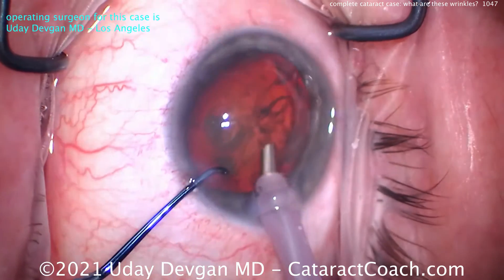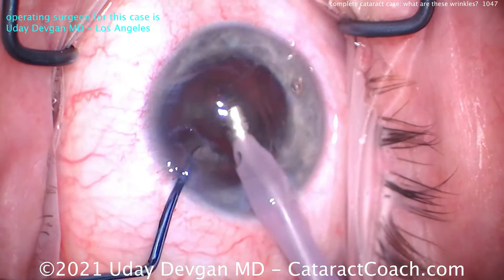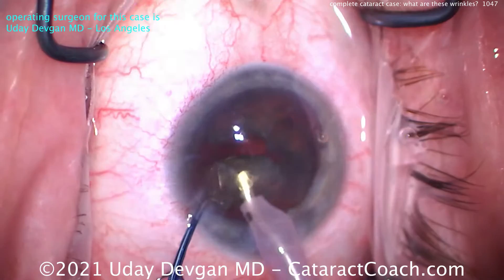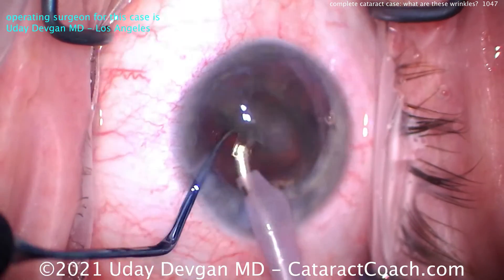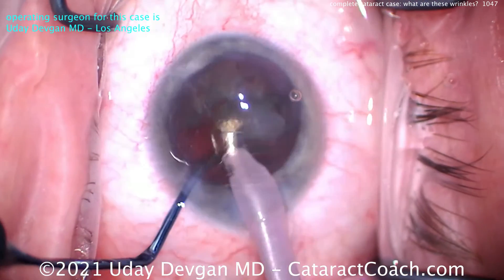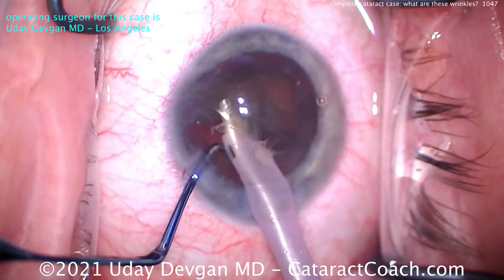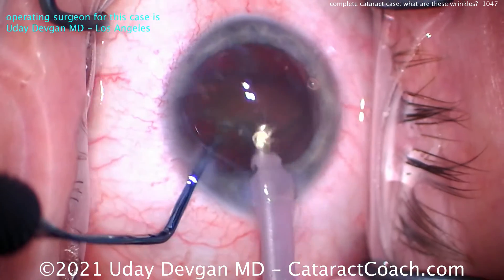Putting the phaco probe inside the eye, here comes the chopper. I'm going to get the probe on one side, put the chopper all the way around to the other side, and boom — split in half. Two halves. The first half is going to come up and can be sub-chopped even more. Looks like a pretty straightforward case here; I don't anticipate any zonular issues. Everything looks pretty reasonable. Just in case though, we did bring the nucleus partially up out of the capsular bag — it's just tilted up. We are not phacoing right under the endothelium; keep this in mind — we are aiming for that iris plane. Half the nucleus is already gone.